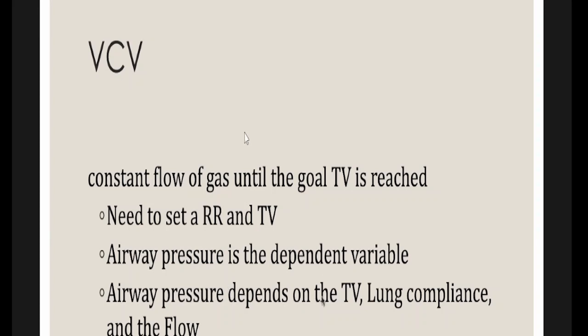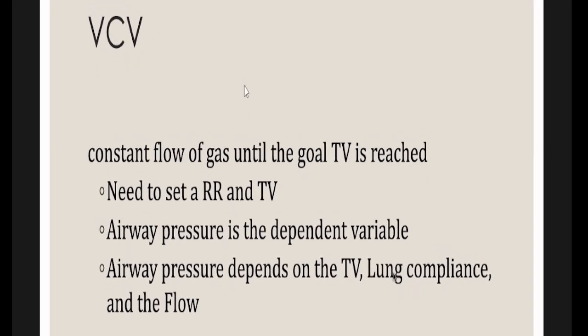Okay, right. So the other problem is, if the lung compliance is low, the airway pressures will be very high. On the other hand, if the lung compliance is high, the airway pressures are low because the lung has more elasticity to expand. All right, and also the flow, because the flow depends on the airway pressure. If the airway pressures are too high, the flow will be less. Okay, right. So those are the sort of variables that we will see on the patient screen.